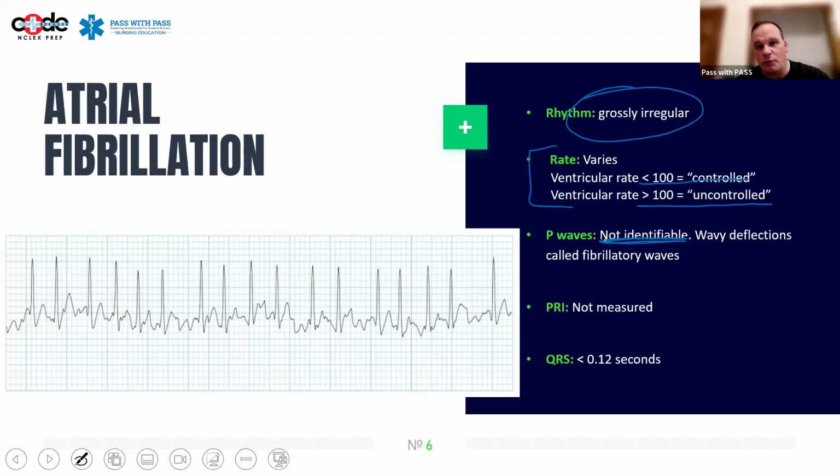What that means is when you're looking at a 4-lead and you're looking at a strip, like the one that's on the screen here, you cannot confidently point to anything on there that says, yes, that's a P wave, right? They're all over the place. It's totally unidentifiable. There's fibrillatory waveform. Your P waves are fibrillatory. So when I look at this, it just looks like a bunch of squiggly waveform or maybe artifact, depending on the rhythm. Regardless, I can't look at it and say, yep, that's a P wave.